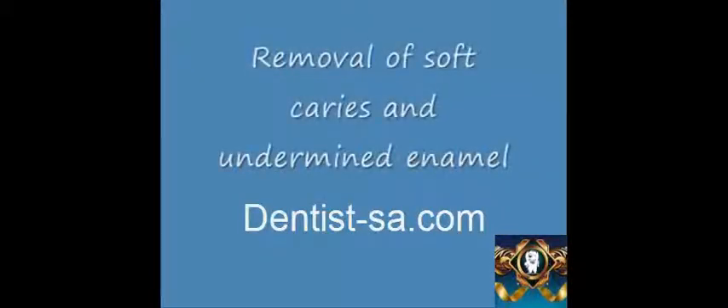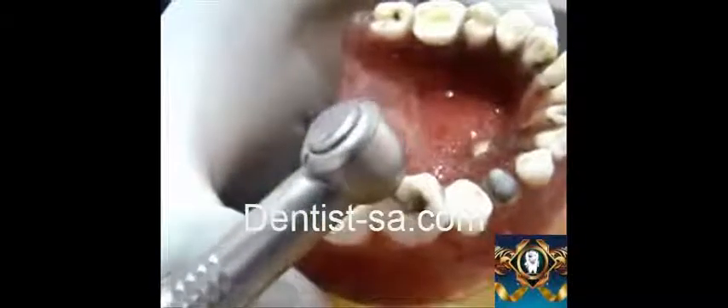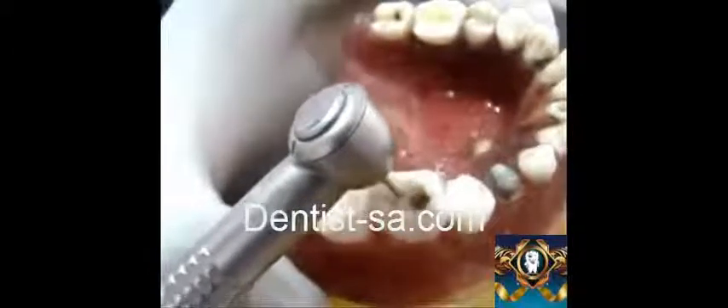The next step will be removal of the soft caries and undermined enamel. This procedure is mainly done using a round tungsten carbide bur. All the soft and leathery caries and the undermined enamel is removed using a feathered stroking motion. Soft caries present at the pulpal floor is removed very carefully so that pulpal exposure is not done.